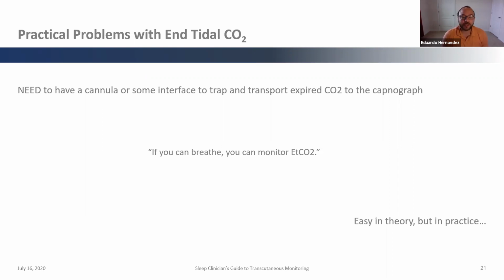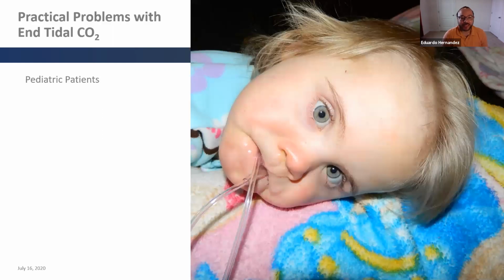Other conditions. Pretty much people have said it's so easy. If you can breathe, you can monitor end-tidal CO2. Now, that's good, right? Because we want to make sure that all of our patients are breathing. If not, we have an issue. We've got to do something about it. So in theory, it's okay, right? But in practice, you see something like this.